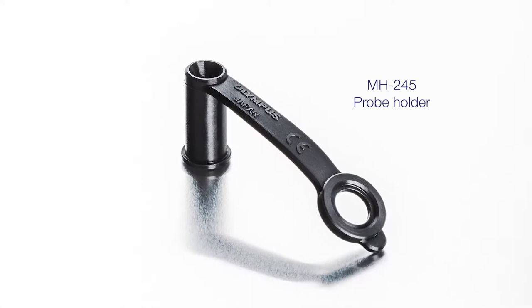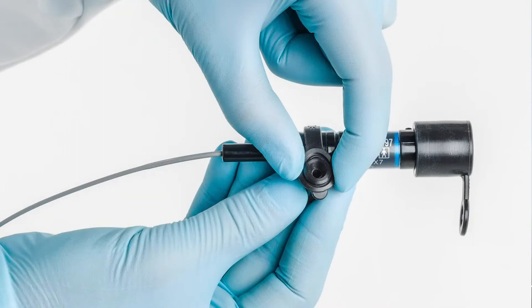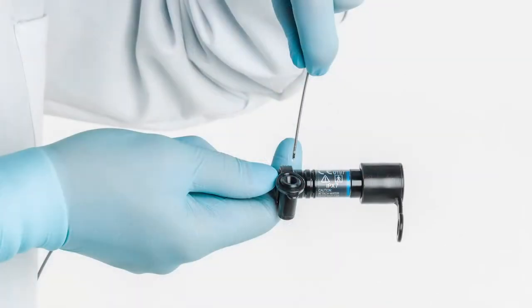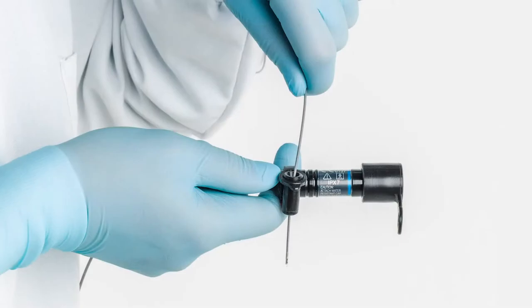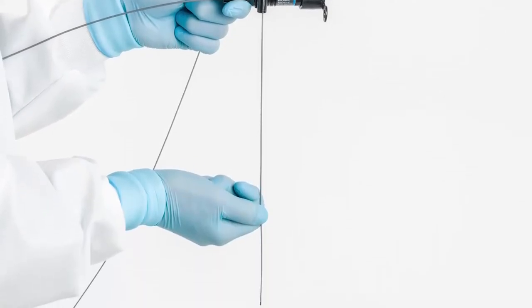Wrap the MH245 probe holder around the probe holder mounting section on the probe connector. Insert the distal end of the probe through the probe holder. There should be one big loop with the distal end hanging below.